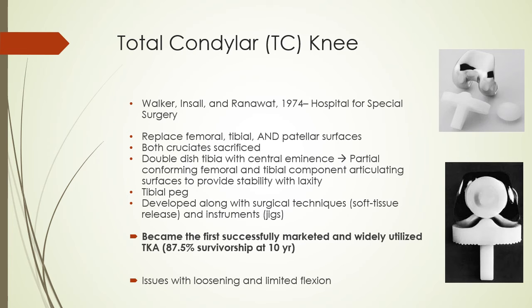The Total Condylar knee is one milestone in the history of TKA. It was designed by Drs. Walker, Insall, and Ranawat. The surgery replaced not only the femoral and tibial surfaces, but also resurfaced the patella. Both cruciates are sacrificed with this design. The tibial surface has a double dish design with a central eminence. This partially conforming articulation provides stability with laxity.